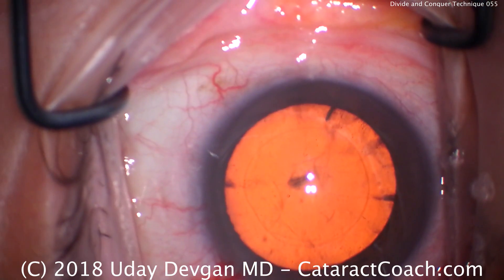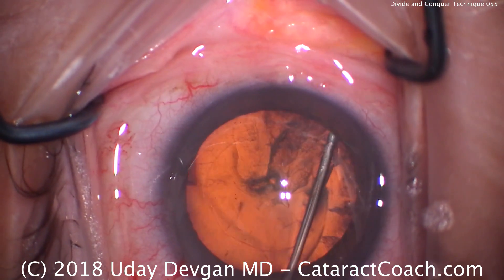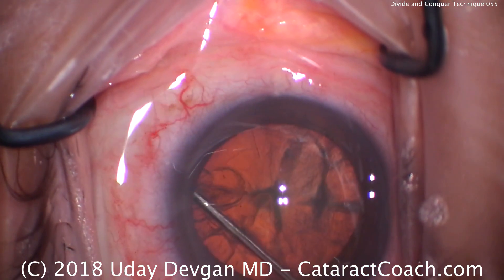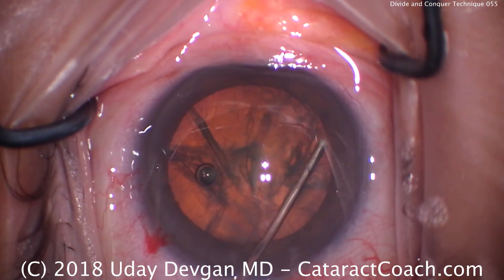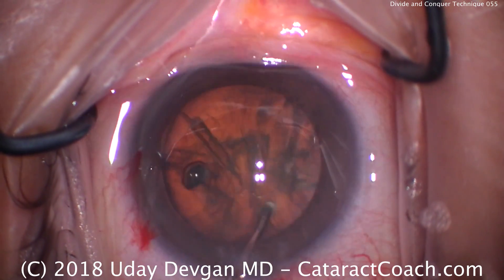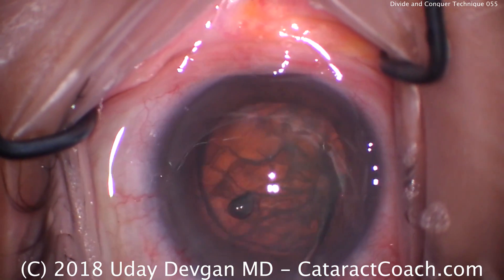Also for divide and conquer we're going to be rotating the nucleus a lot, so you definitely want good hydrodissection. There's a couple of fluid waves — we'll go in the other direction. The nucleus must be able to rotate prior to starting a divide and conquer technique, so take your time here. It doesn't rotate so well, so do more hydrodissection. We must have good hydrodissection. There it is — there's a good rotation.